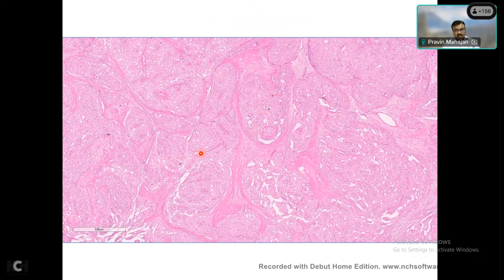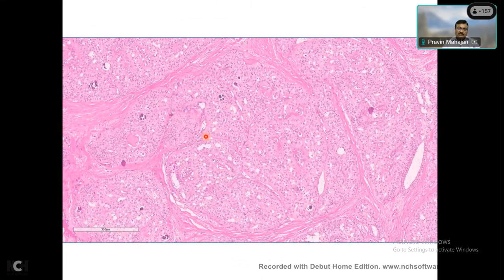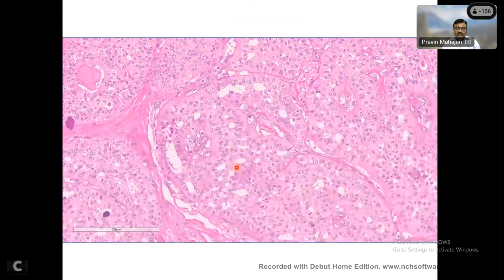And you go on to another power, you start to see there are nodules here. You start to see some microcalcifications here. At another high power, you start to see microcalcification. And within these nodules, you see there is this proliferation, which looks rather columnar-like. You see columnar-like proliferation, and within the nodules there are also these fibrovascular septae. You can make out these fibrovascular septae.